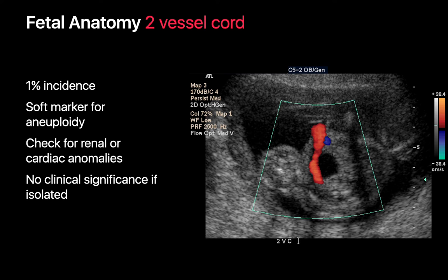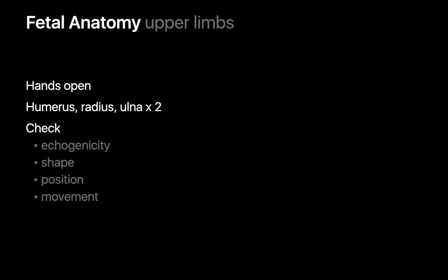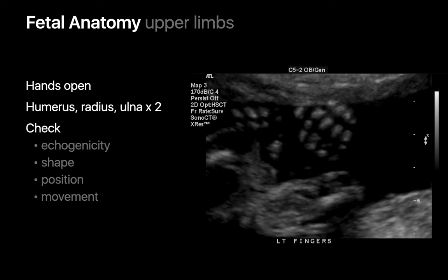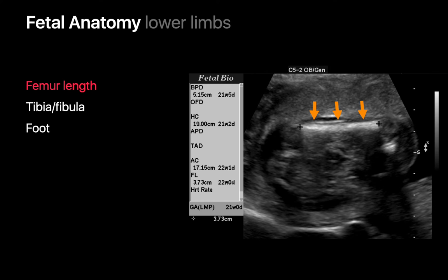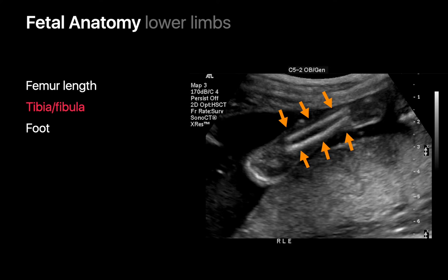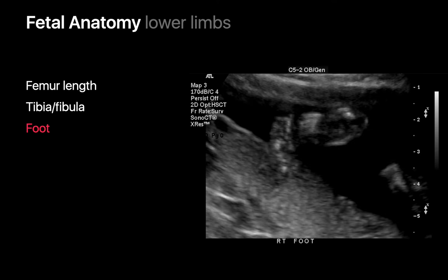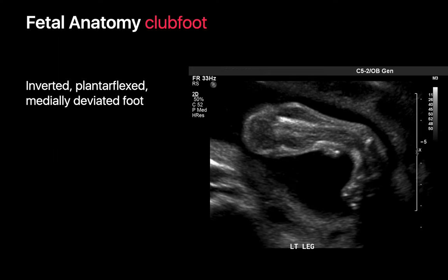We finish with an assessment of the fetal limbs. For the upper extremities, we evaluate the humerus, radius, and ulna on both sides, how the upper extremities move, and ideally the fetal hands and fingers. Our evaluation of the fetal legs involves measurements of femoral length, evaluation of the echogenicity, shape, and position of the tibia and fibula, and finally the feet and ankles. This is the portion of the fetal assessment where we can catch anomalies like clubfoot.